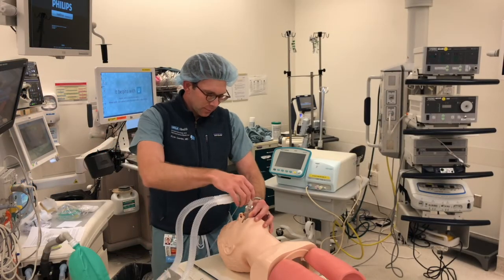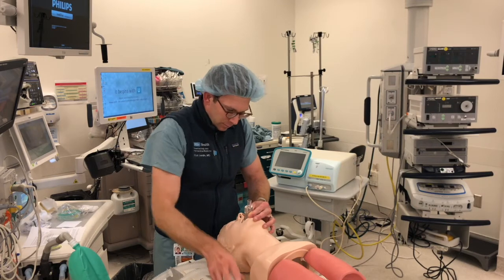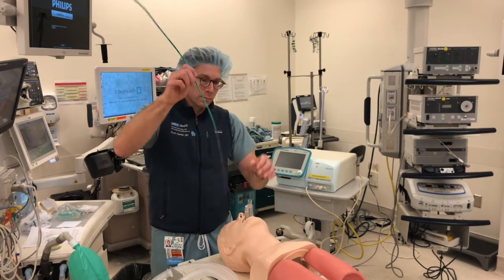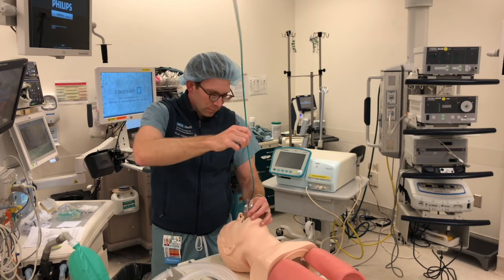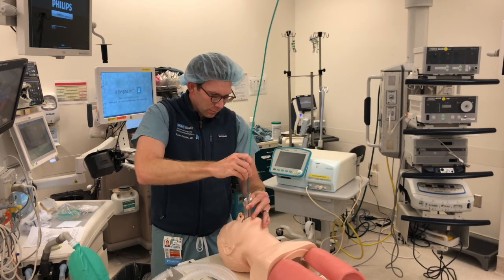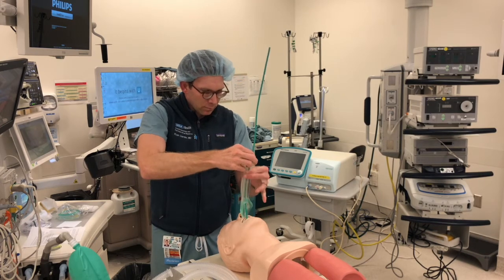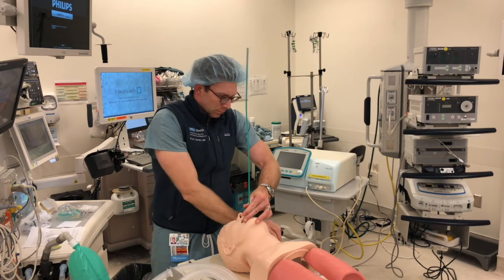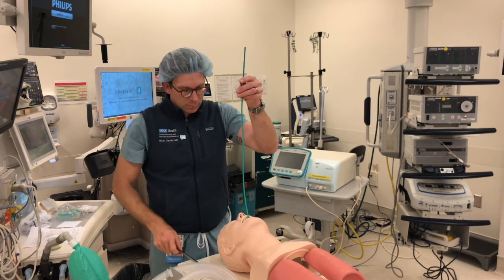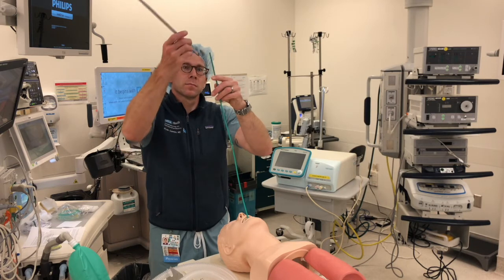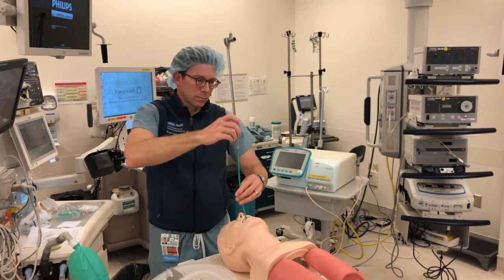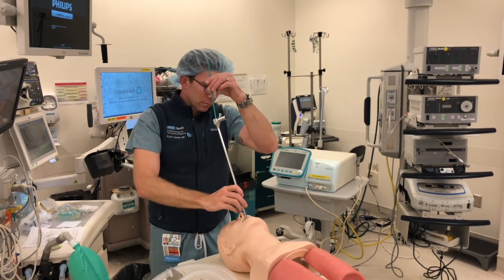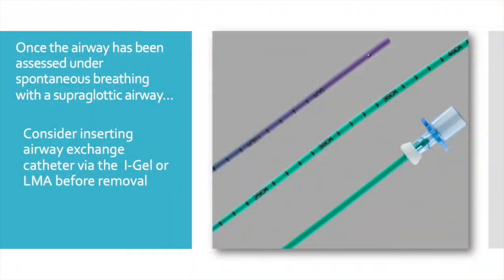Once you've assessed the airway while the patient is spontaneously breathing, it's not a bad idea to pass an airway exchange catheter before you take out the supraglottic airway. This will help whether you're going to intubate or the surgeon is going to take over the airway by providing a direct visual pathway to the vocal cords. Here we're using a double lumen tube exchanger, which will fit right through the i-gel. It has a soft purple tip to reduce the risk of trauma to the airway, and there's plenty of length to easily pass a rigid bronchoscope, an endotracheal tube, or whatever airway device you're going to use.